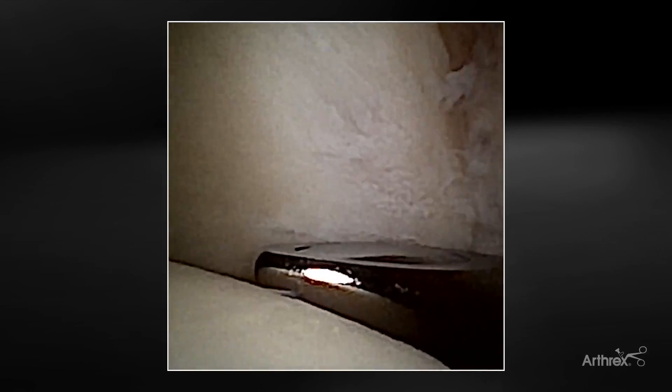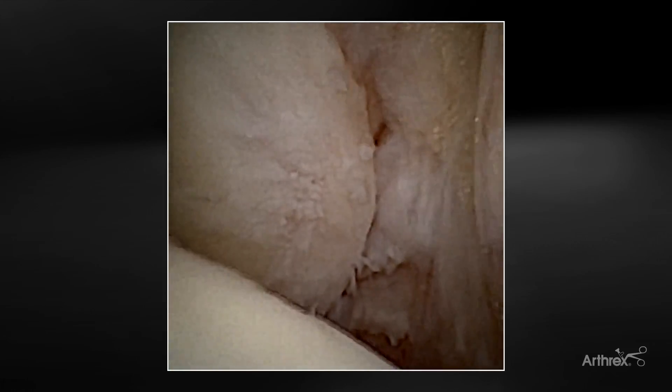The last maneuver I'll show you is the medial drive-through sign. I usually use the 4-0 torpedo, but this is a 3-5. Our recent studies are showing the 3-5 might be the cutoff to diagnose deltoid instability. With fluoroscopic evaluation, knowing what we know about the medial gutter — if you can fit this shaver into the medial gutter, think about what the talus is doing, how much widening you have and how much incompetence of the deltoid. This would be a positive drive-through sign. If I can fit that in between the medial gutter, in my opinion you should open up the deltoid and do a medial repair. We have data starting to show that and confirm it's a good validated test. Most of the time if the deltoid's intact, you cannot get this in — it should be nice and tight. But if you can fit it in, you have a chronic deltoid tear, and I think it's warranted to open and repair.